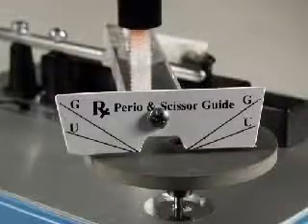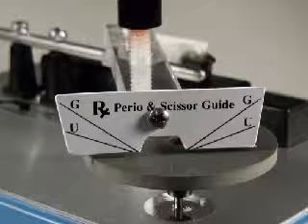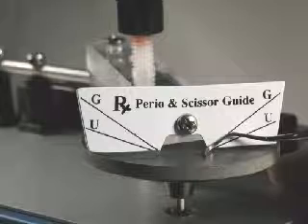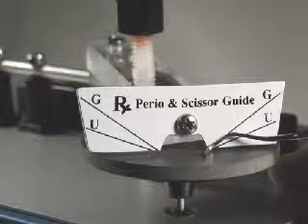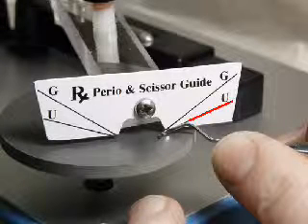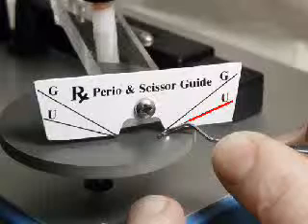This DPS guide is the key to getting accurate angles on all curettes, scalers, and scissors. The proper angle is obtained for this Gracie curette when the terminal shank is lined up with the line marked G. The line marked U is for all other universal curettes and scalers.